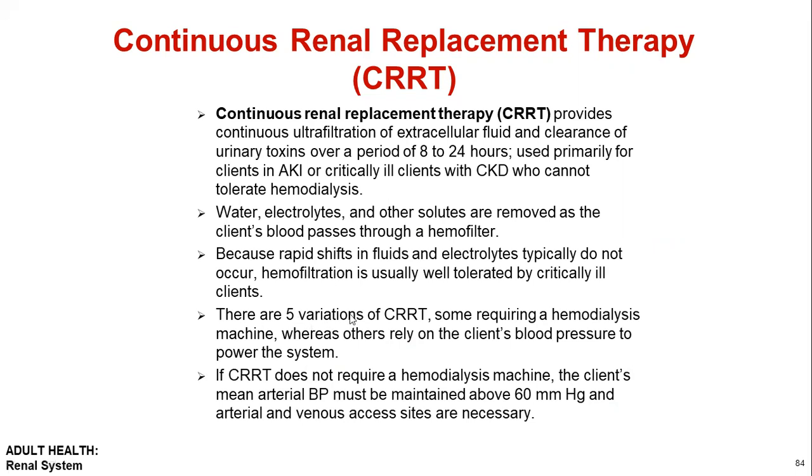There are 5 variants of continuous renal therapy. Some require a hemodialysis machine, whereas others rely on the client's blood pressure to power the system.